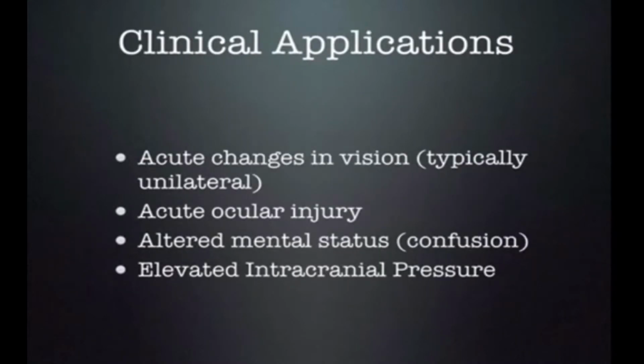So when do you want to use it? Well, I typically use it when there's an acute change in vision. Usually this is a unilateral change of vision, as bilateral changes in vision are generally not related to the eye itself. Whenever there's an acute ocular injury or suspected ocular injury. Whenever there's altered mental status or confusion in the patient. Or when I suspect that there may be elevated intracranial pressure.